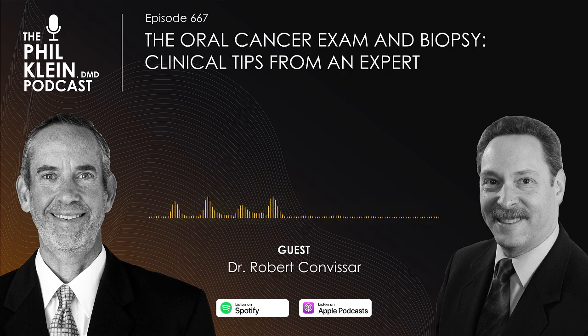Once the biopsy is completed for healing purposes, do you typically suture or do you often rely on secondary intention for healing? And I assume this is related to the size of the biopsy itself. Depending on the size of the lesion, because I use a laser most of the time, I rarely suture. And in the past, when I used the blade, same thing. Most of the time, you just let it granulate in by secondary intent.